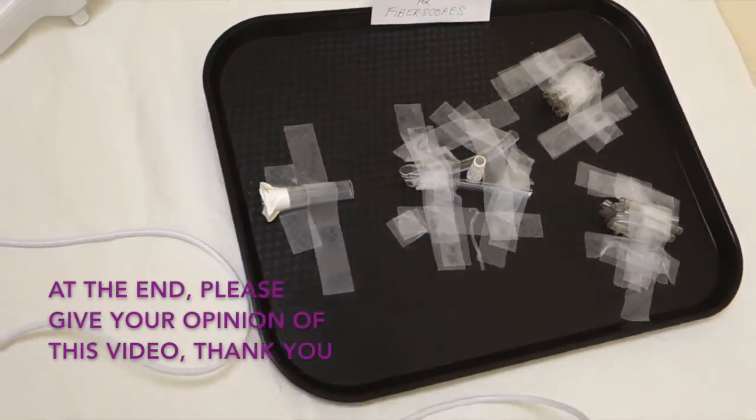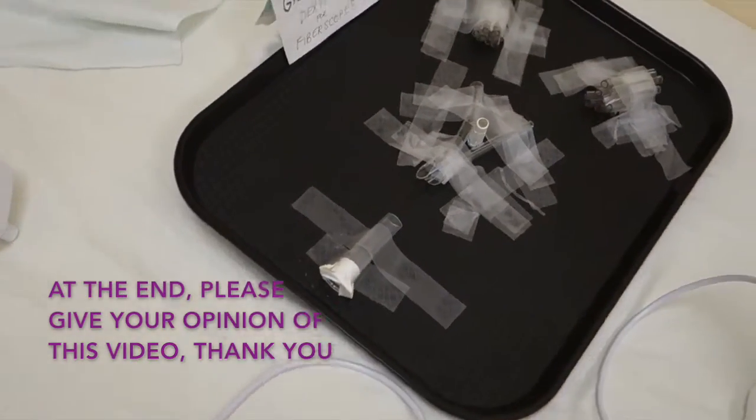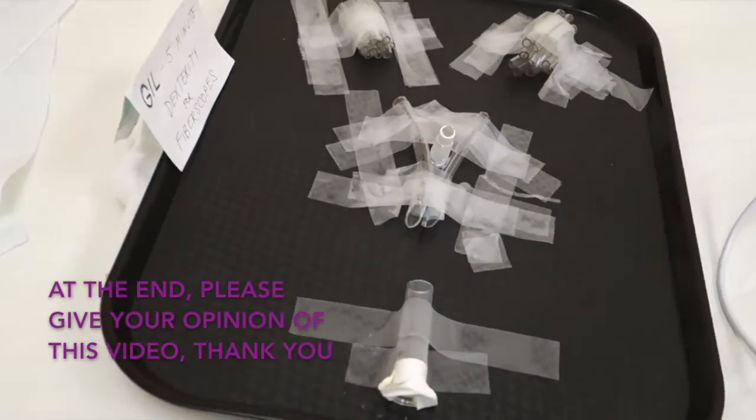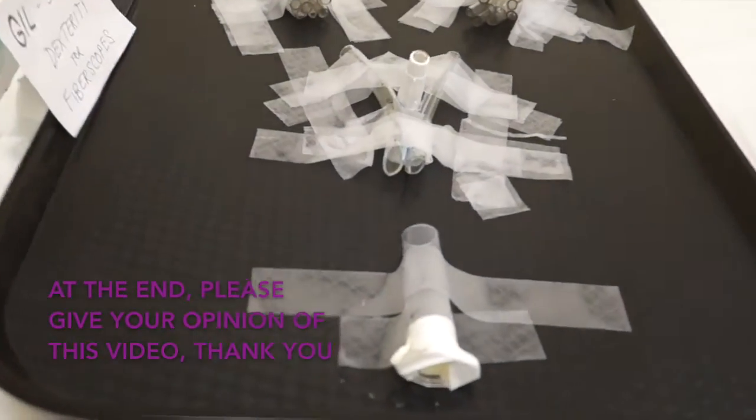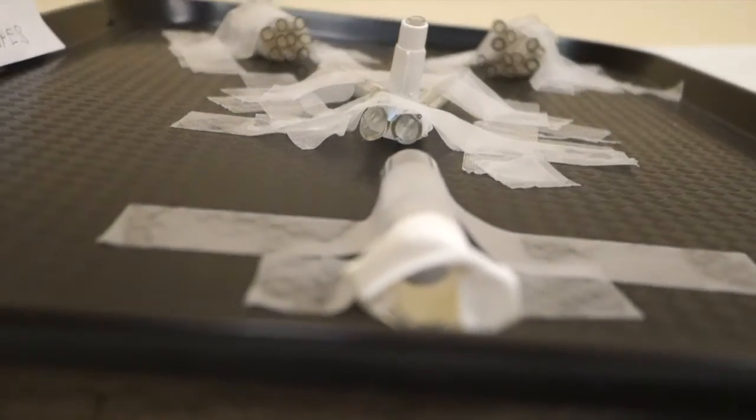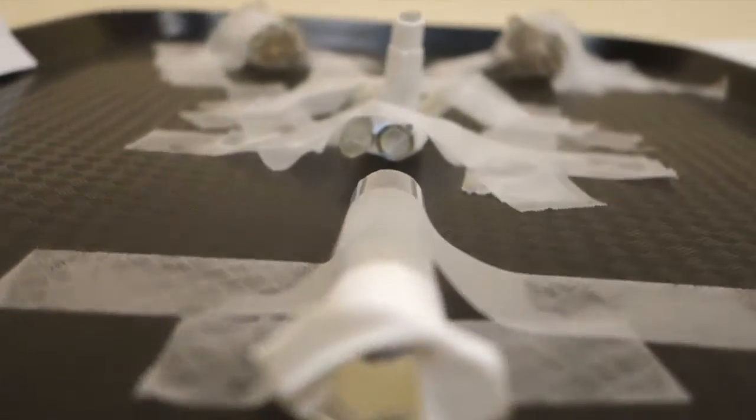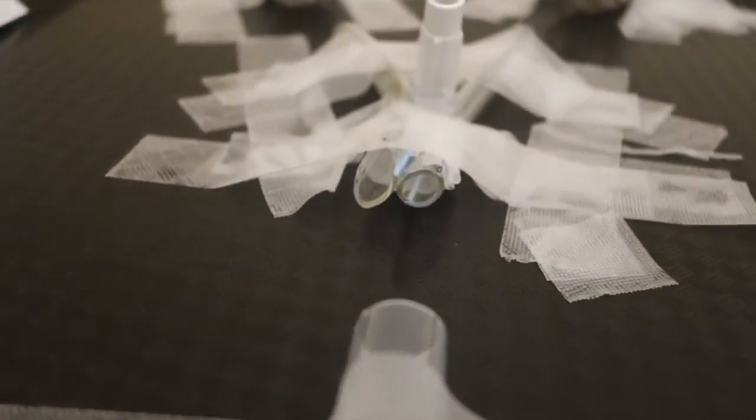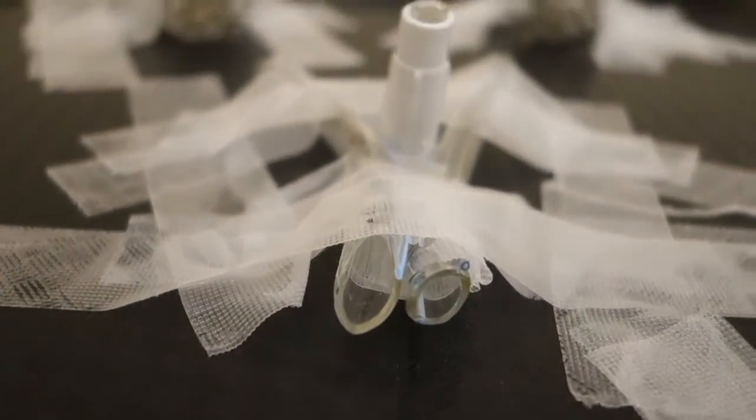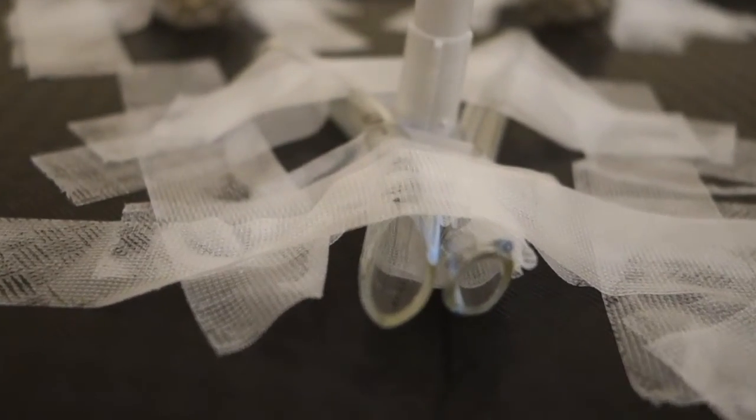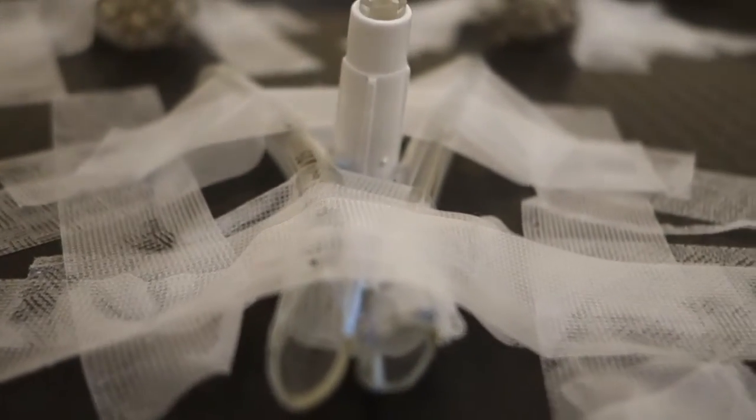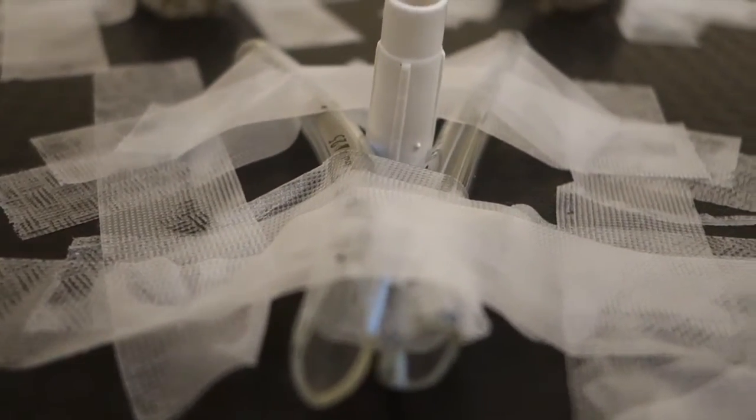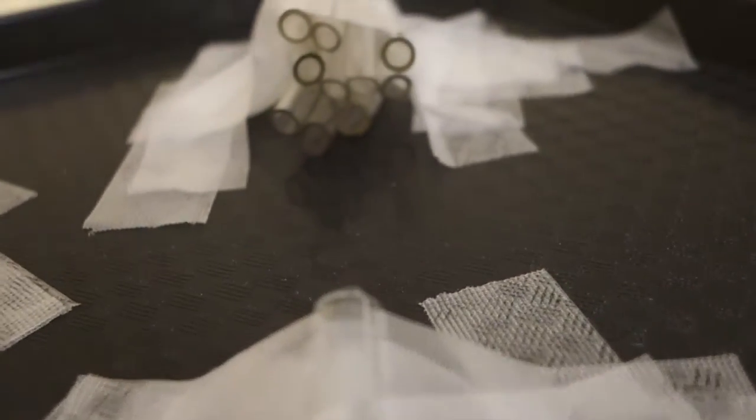I'm going to swing around so that you can see the approach that you would make with the fibroscope. Here's a fake trachea and fake vocal cords made with cut-off syringe and tape. And there are two cut-off endotracheal tubes like fake bronchi. You can pick one or the other, and then you go down that fake bronchus and go to the target area of cut-off pieces of suction tubing.